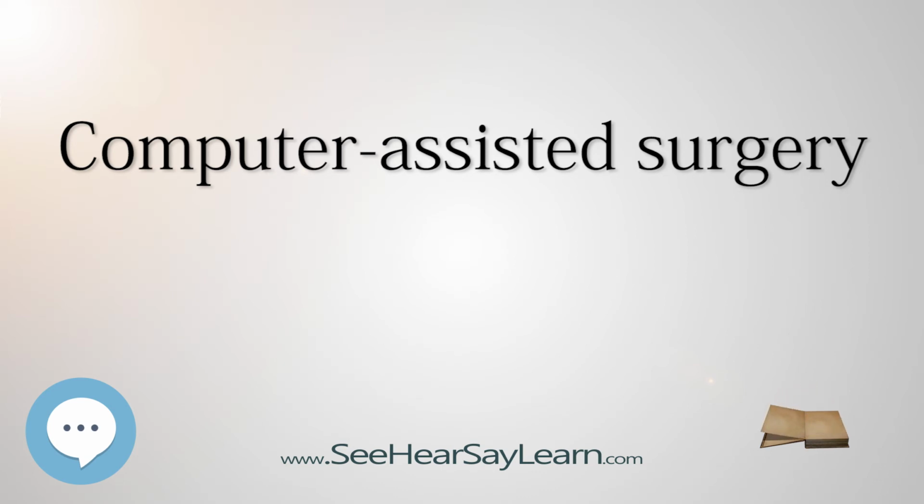At the same sitting, the patient receives the implants and the prosthesis. An interim prosthesis is not necessary. The extent of the surgery is kept to a minimum. Due to the application of the splint, a reflection of soft tissues is not needed. The patient experiences less bleeding, swelling and discomfort. Complications such as injuring of neighboring structures are also avoided.